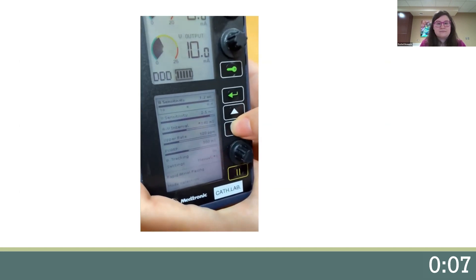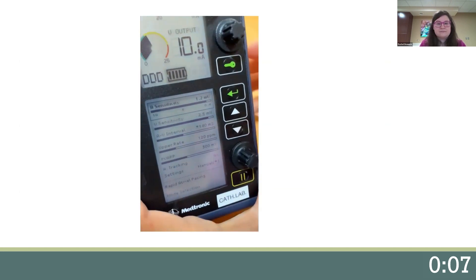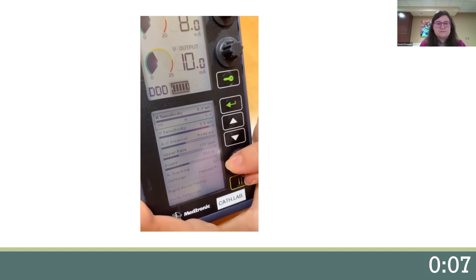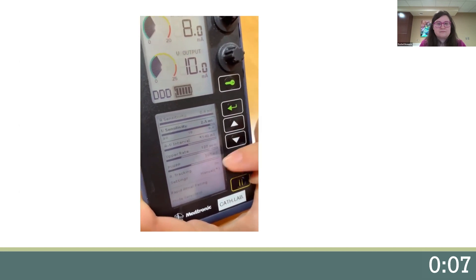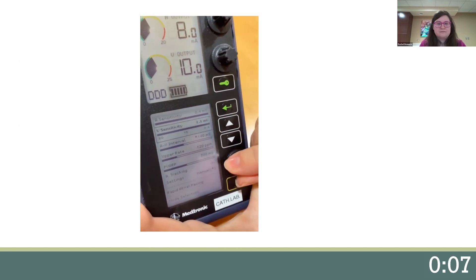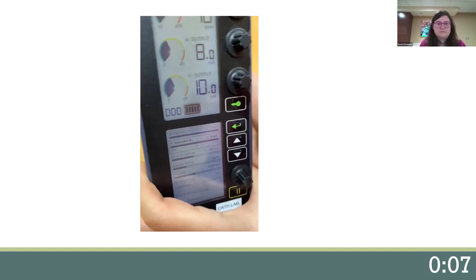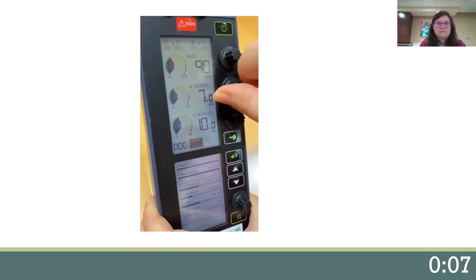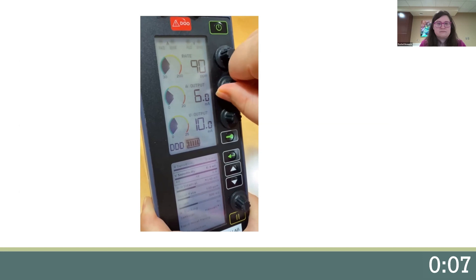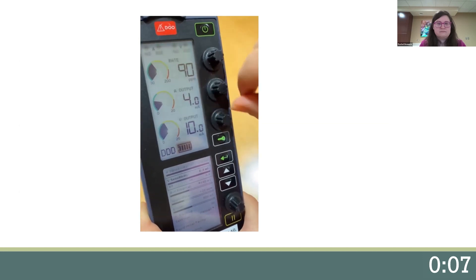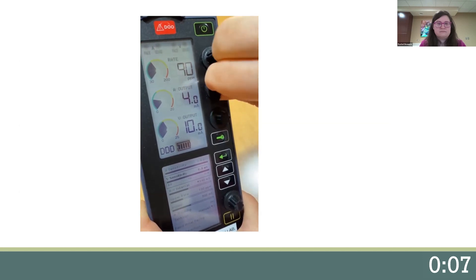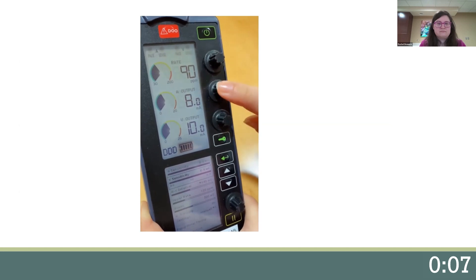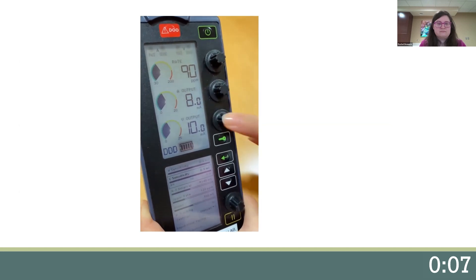The next thing I'm going to do is set the sensitivity. I want it to be the most sensitive possible, so I'm going to turn all the way to the right to the lowest millivolts. Next, I'm going to find the electrical capture and find the lowest amount of energy needed to produce a beat. Once I find that lowest level, I'm going to set it to twice that. I'll do that for both the A's and the V's.